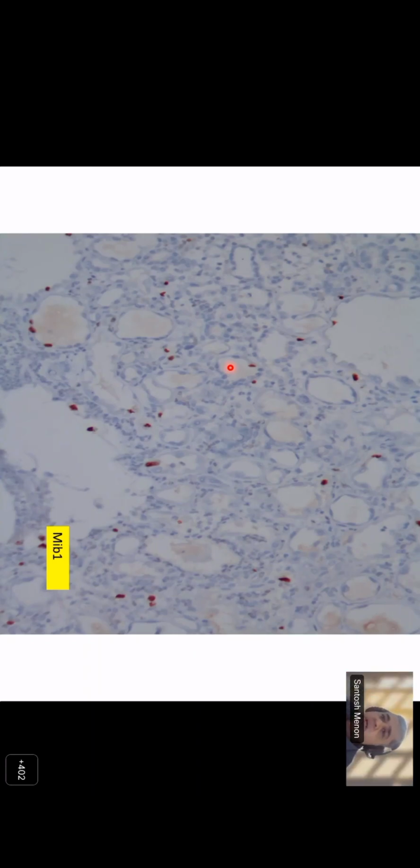So my point is, you are a clinician. You have to ask questions. You have to look at radiology. You ask for serum tumor markers. The CEA was normal. The other tumor markers were normal in this. The problem is they look so malignant, they look so signet-like.